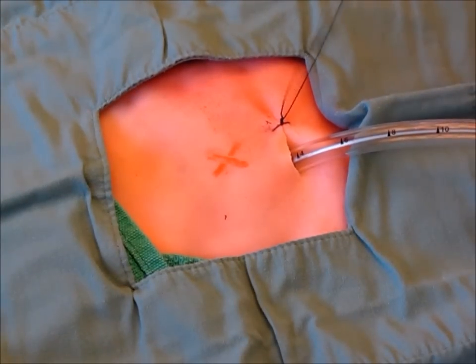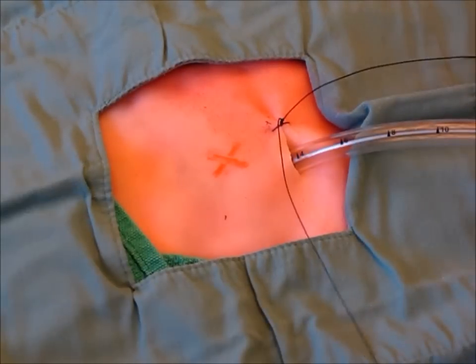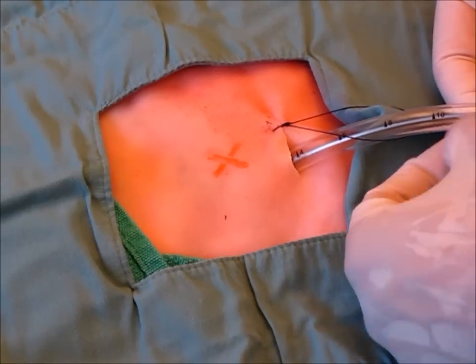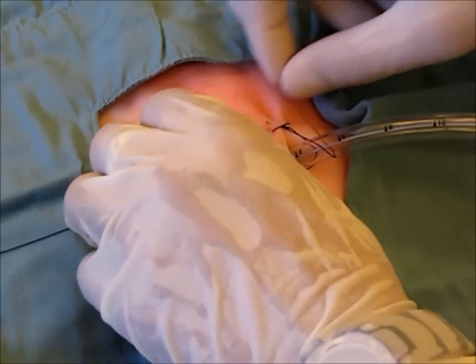When securing the chest tube, it is important to wrap the chest tube in both directions using the silk. The previous sandal tie is no longer accepted, as the chest tube can become loose.